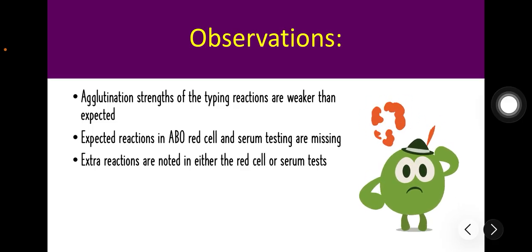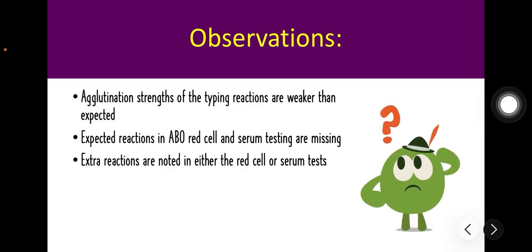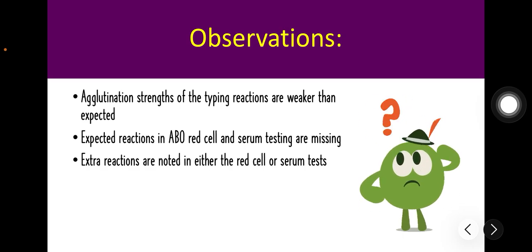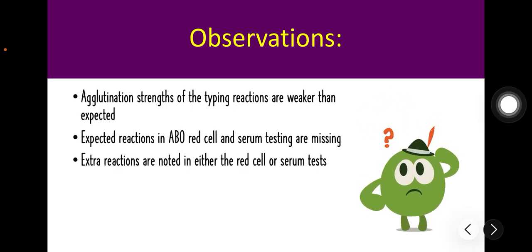So you also have the B(A) phenotype. A group B individual may react weakly with anti-A because their B enzyme is so efficient that it accidentally attaches trace amounts of the immunodominant sugar of A to the red cells. We also have Wharton's jelly. In cord blood samples, this gelatinous substance can cause the red cells to stick together non-specifically, looking like a positive reaction.